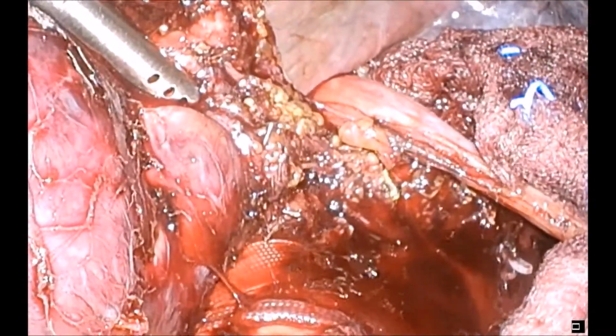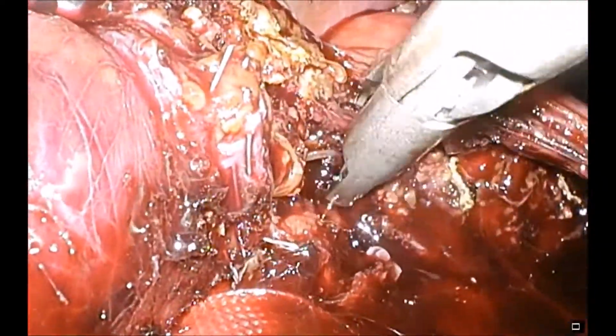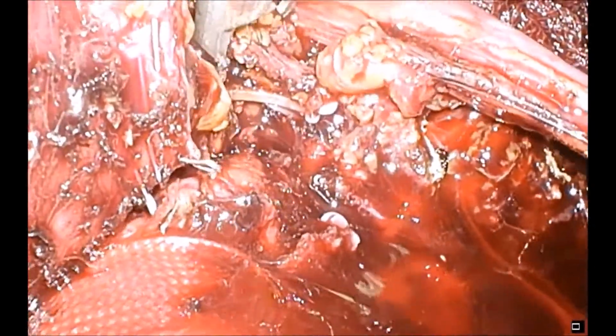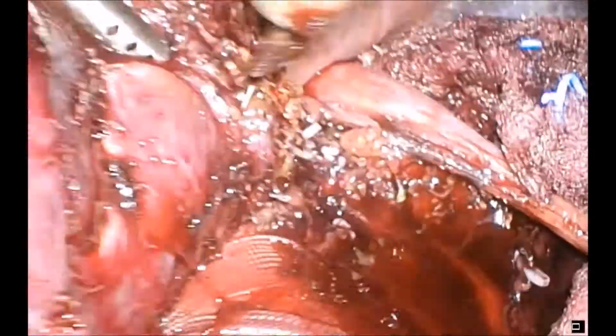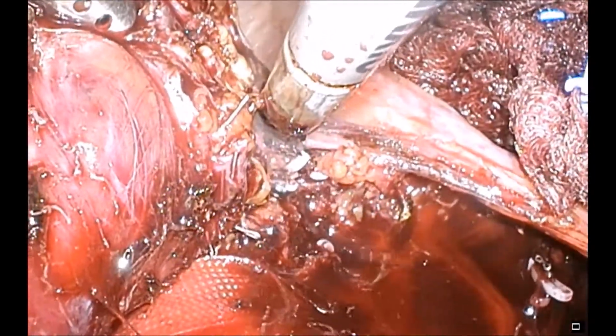The parenchyma is really quite thin here. A fibrous structure is seen, may represent a small vessel, and therefore a hemalock clip's placed.